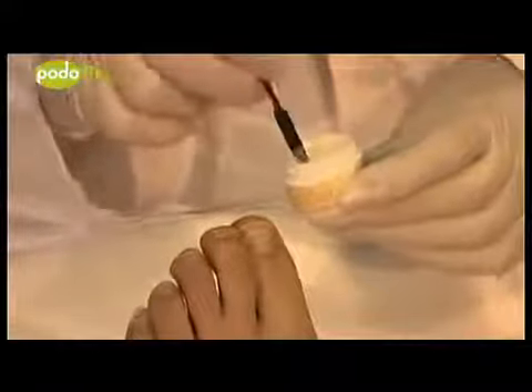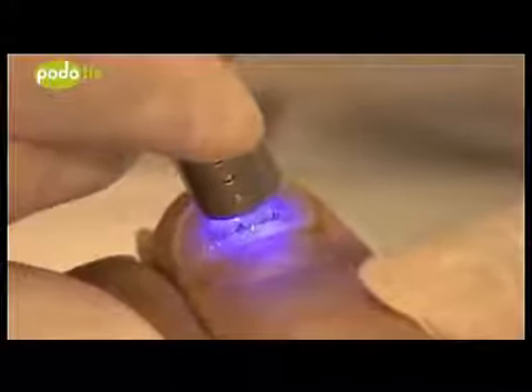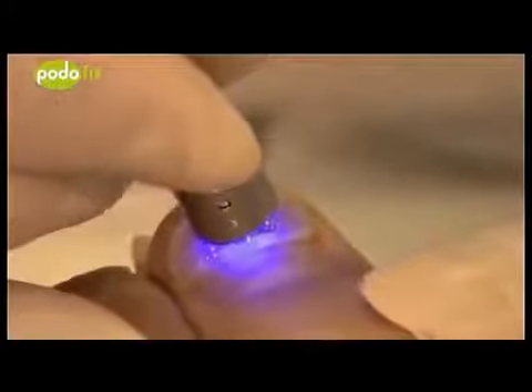Now use a nail file to smooth off the wire ends. To seal the Podofix brace, use the spatula to place a drop of Pedigel into the recess of the brace. Activate the 3TO microlamp and harden the Pedigel by lighting it for 20 seconds, holding the microlamp at the smallest distance possible from the area to be sealed.